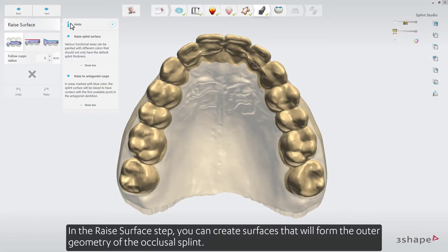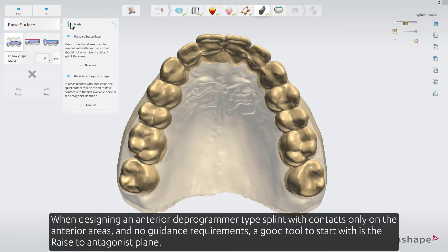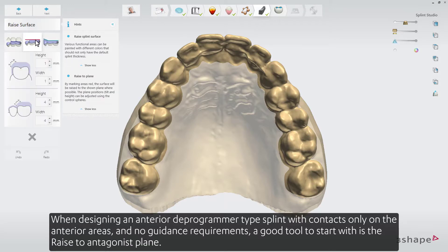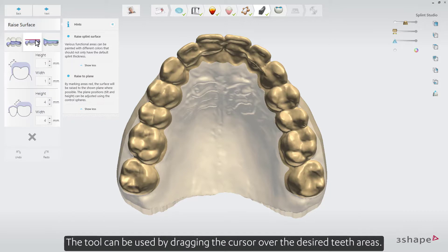In the raised surface step, you can create surfaces that will form the outer geometry of the occlusal splint. When designing an anterior deprogrammer type splint with contacts only on the anterior areas and no guidance requirements, a good tool to start with is the raised to antagonist plane. The tool can be used by dragging the cursor over the desired teeth areas.